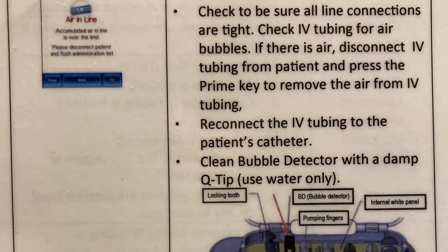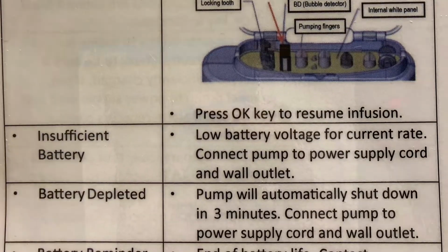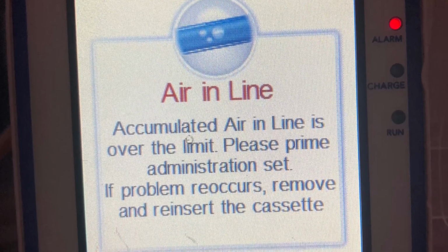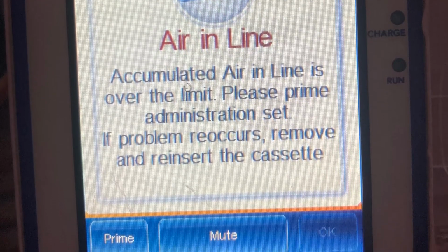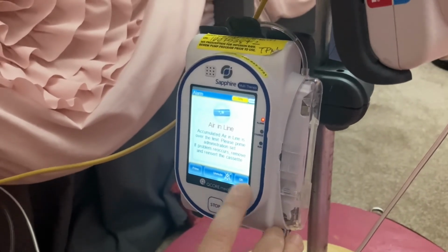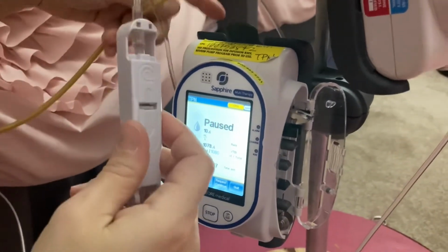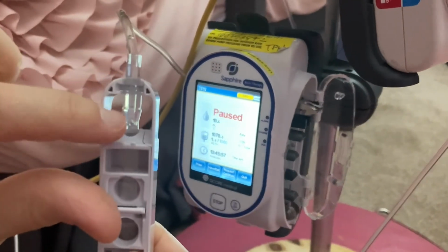Here are a few more problems and solutions. I will talk more about the air in the line next. This is the air screen when too many air bubbles accumulate in the cassette. The previous screen showed some troubleshooting techniques to resolve this, but this is what works for us. So the first thing you want to do is press mute and OK, so it mutes the sound for a bit. Pop the cassette out, and this is where the bubbles get caught, right in this little area right here.